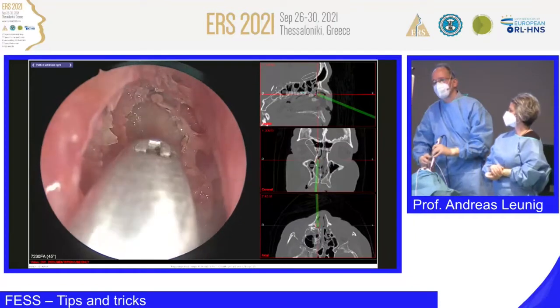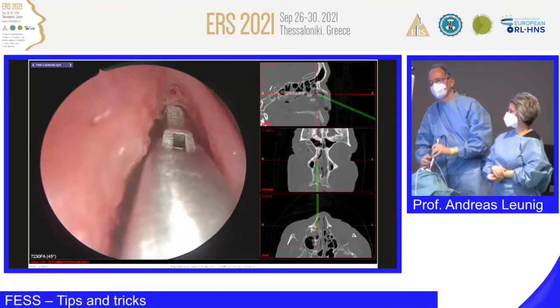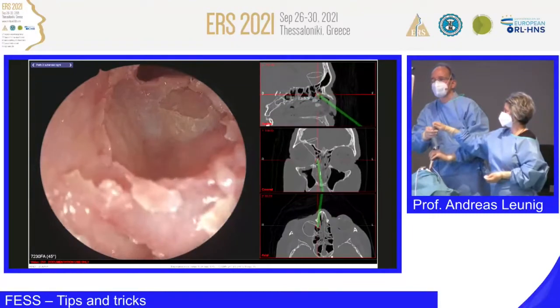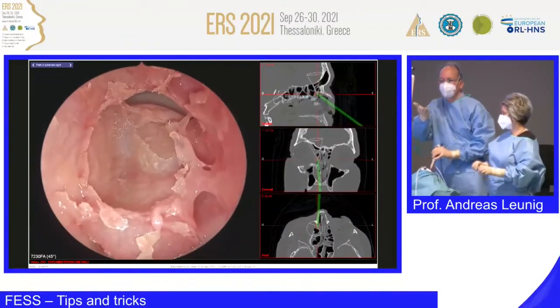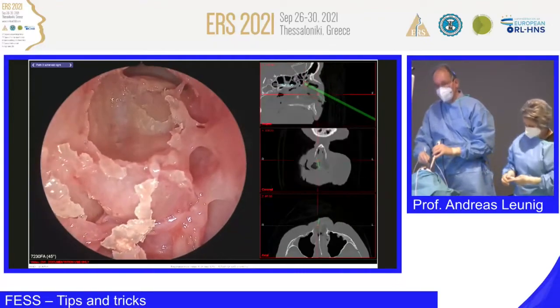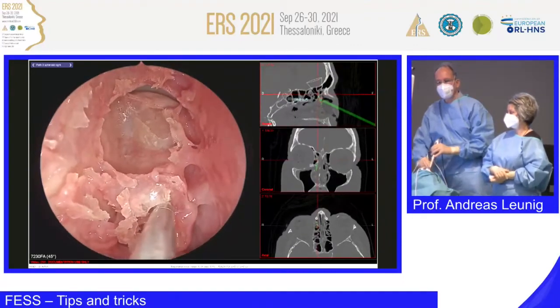And usually when we talk about the anterior ethmoid artery, I don't go for the artery and look and always want to see it. Sometimes I see it, sometimes not, it's okay. But as long as you see it, it's fine. Don't touch it. So now, this is the entrance into the frontal sinus. But I think there's still some space behind, some cell compartments. When I checked this anatomy yesterday, I thought, oh, it's not very easy. You see, here behind, that's not skull base.